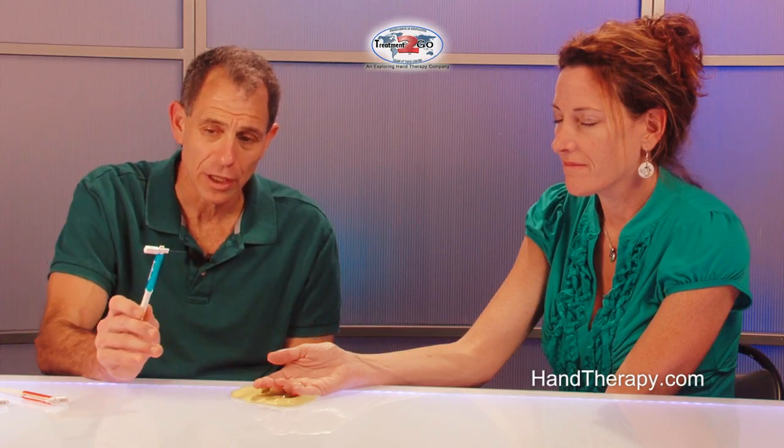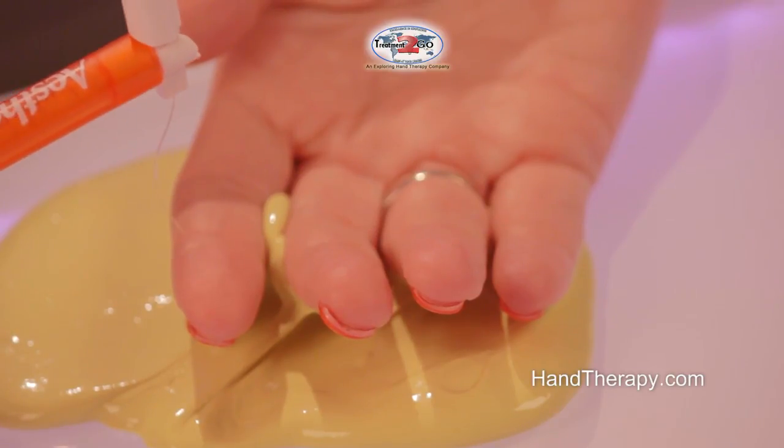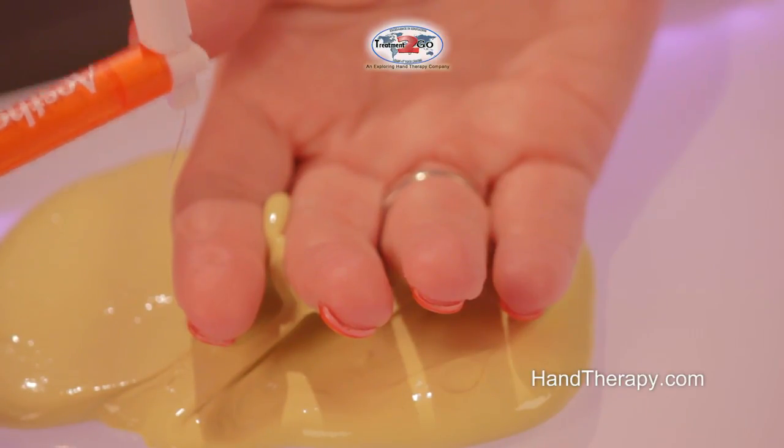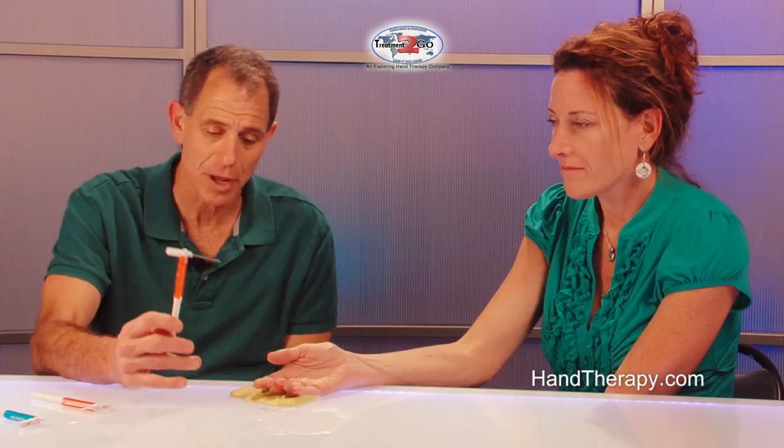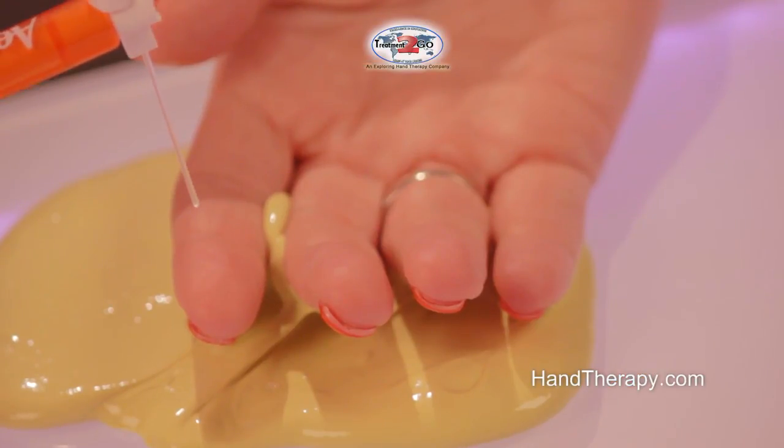If they can't feel that specific diameter, we go to the next thicker one and do that three times, deforming it to a letter C. If they still can't feel it, we go all the way up until we get to the thickest monofilament, which is 6.65.